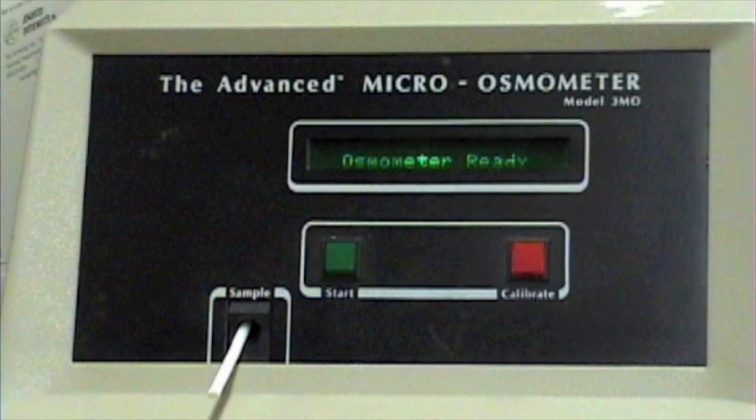The calibration of the advanced microosmometer is a simple procedure involving the analysis of two calibration standards. If repeatability is acceptable, the instrument will automatically perform an internal calibration. The necessary calibration standards are the 50 milliosmol per kilogram and the 850 milliosmol per kilogram calibration standards.